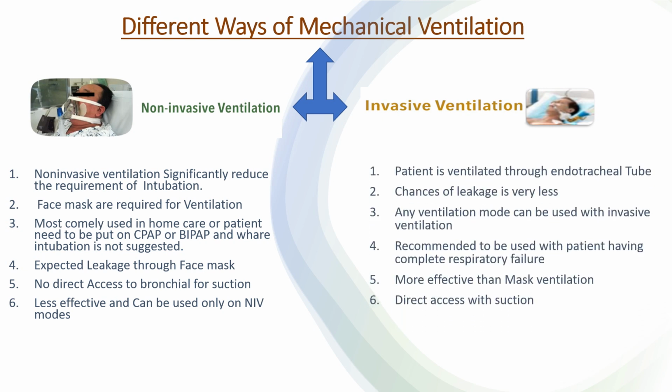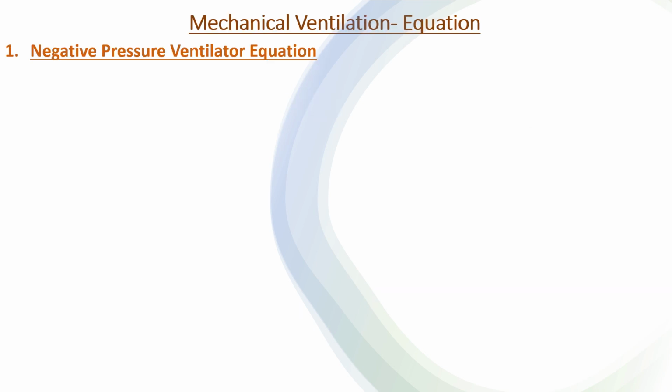In invasive ventilation, the patient is ventilated through an endotracheal tube. Chances of leakage are very low. All ventilation modes can be used with invasive ventilation. Recommended to be used with patients having complete respiratory failure. More effective than mask ventilation. Direct access with suction.